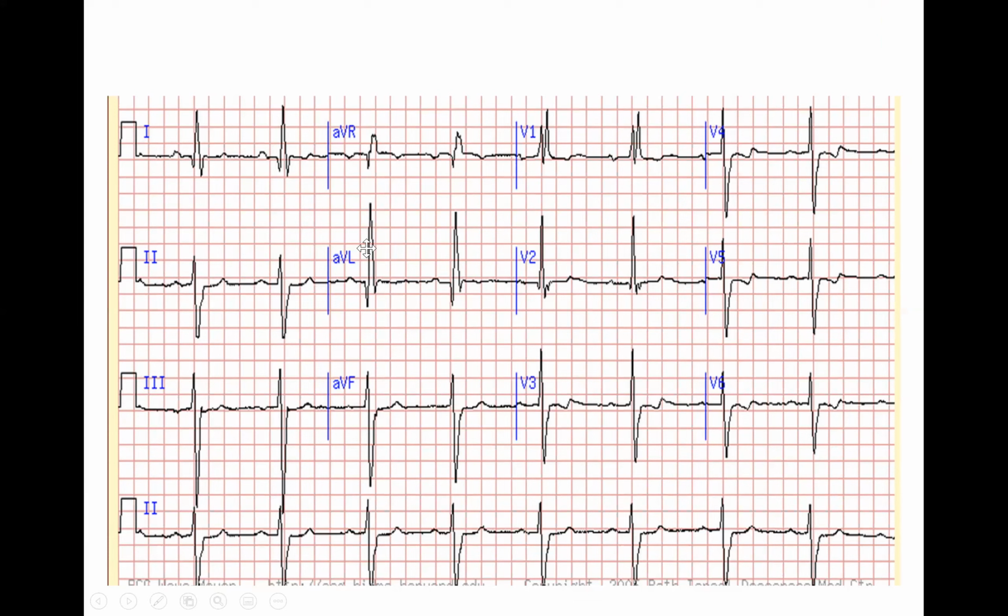Okay, so as he mentioned, to not miss anything, thank you for this point, and you are right. But when you read the ECG, we have to read it systematically. Remember, for all of you. Once you're done with the P wave and the PR interval, then go to the axis and the QRS. If you look, the axis is more toward the left. What's causing this left axis? You can see the voltage across the whole ECG is high. Applying all criteria, they are positive.